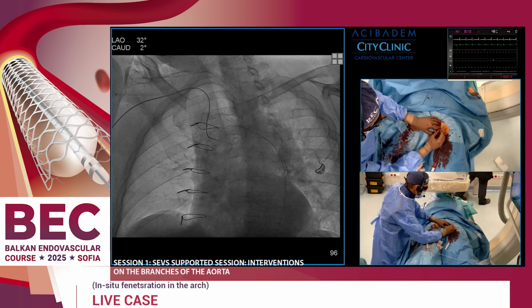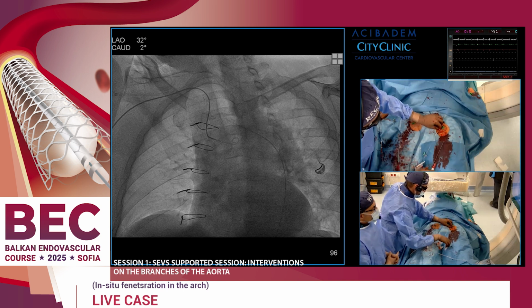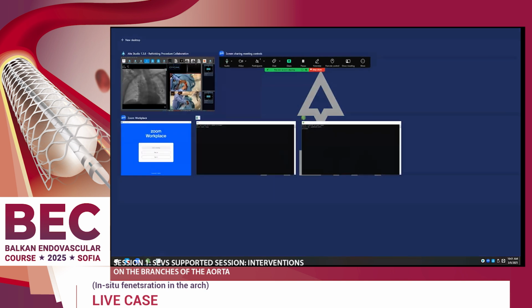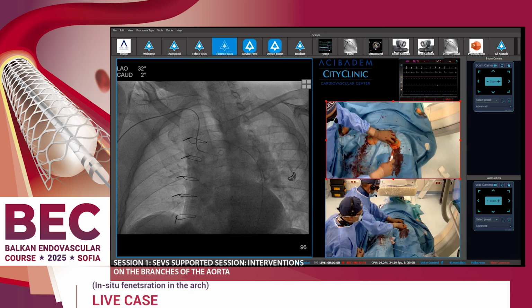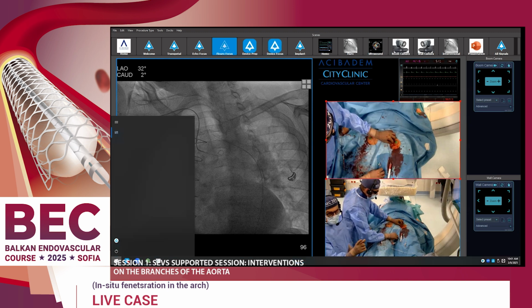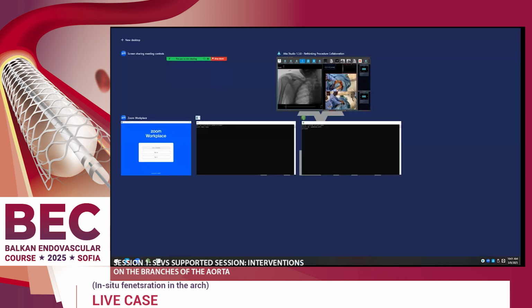Are we ready with the PowerPoint? Let's upload the PowerPoint, and we are going to explain more. In the meantime, Professor Stankov has done several very important steps. So we are going to show you the progress up to now, starting from the first angio.